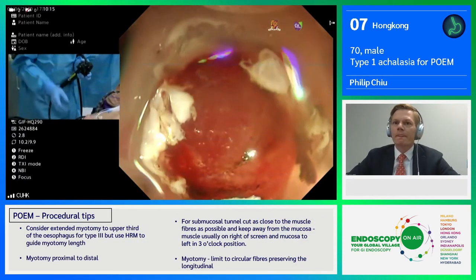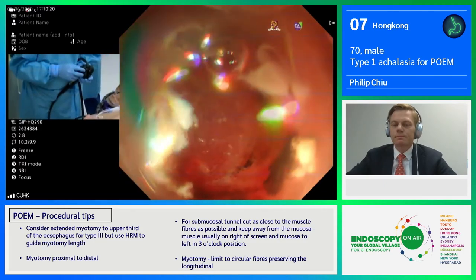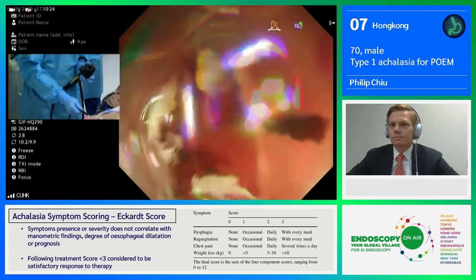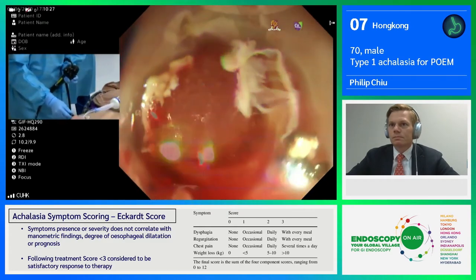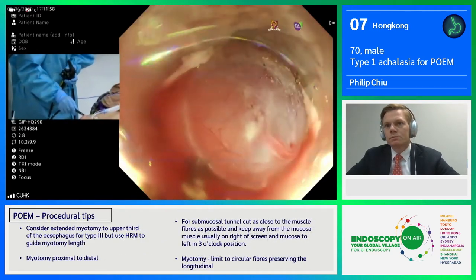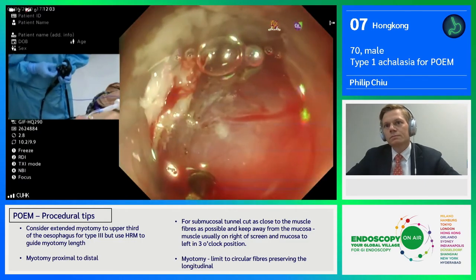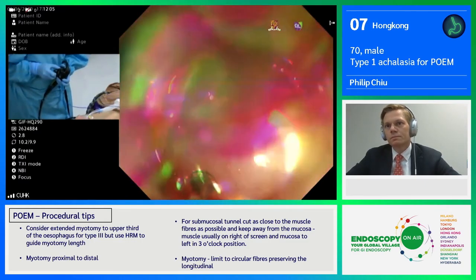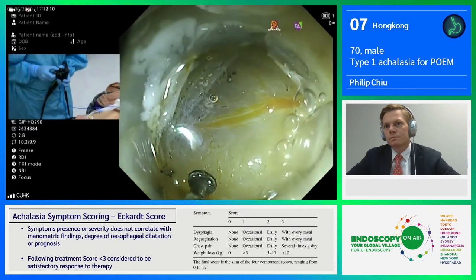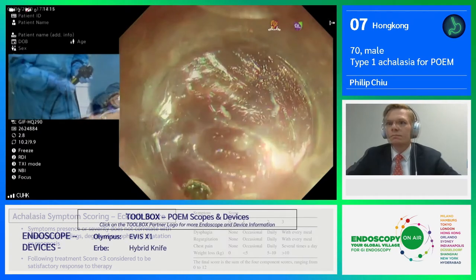For my practice, I usually look at the mucosa, and if the entire circumference of my cap can catch the mucosa, then I think I can enter into the submucosal tunnel. Just a little bit more. This vessel is much enhanced by the RDI mode, so you can see that. Now I think I'm in.